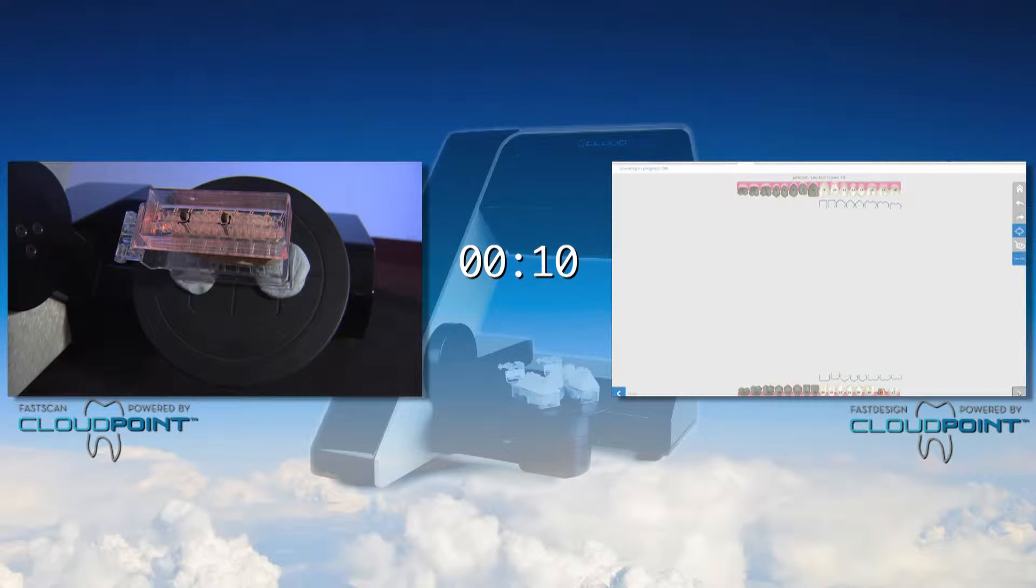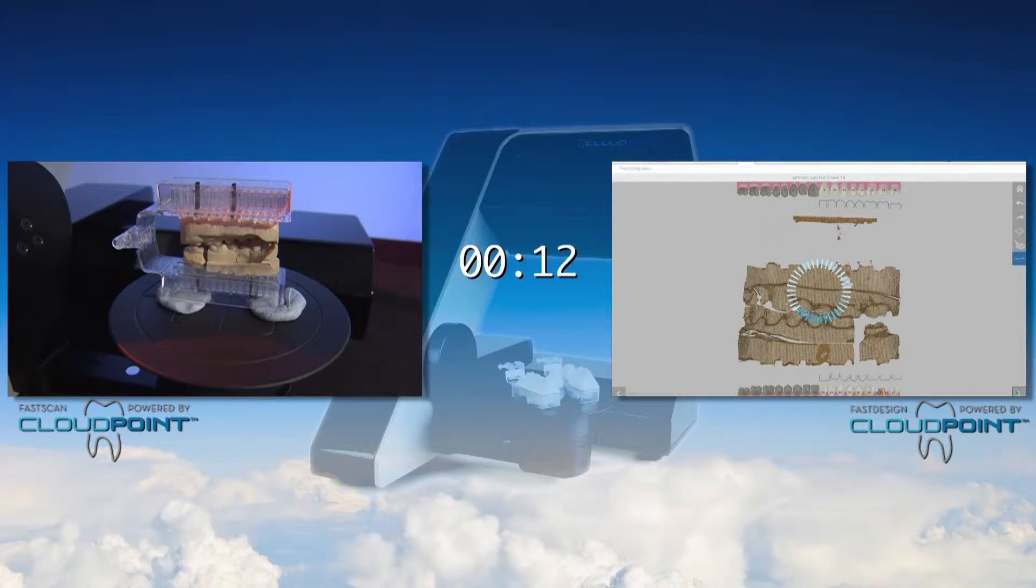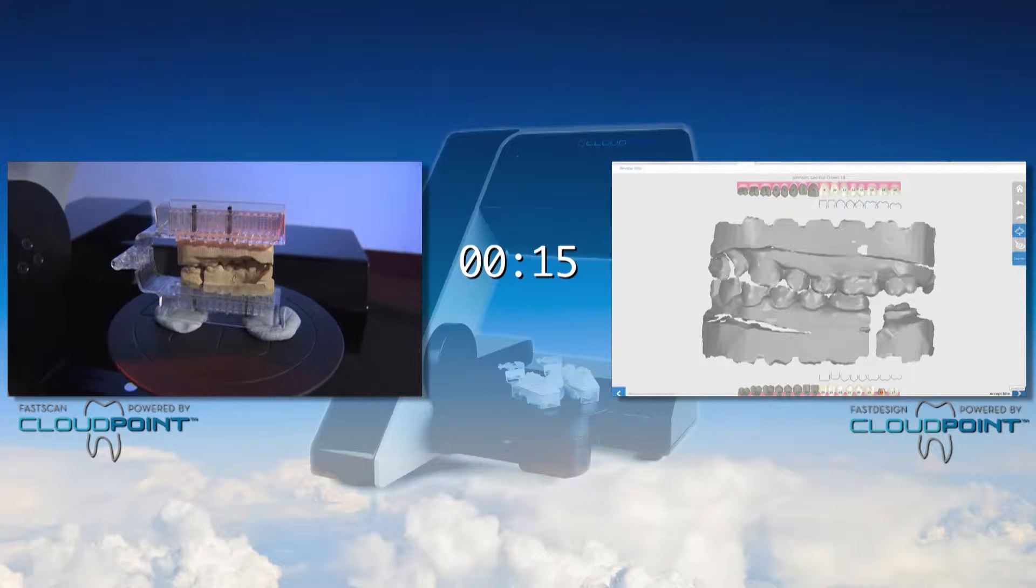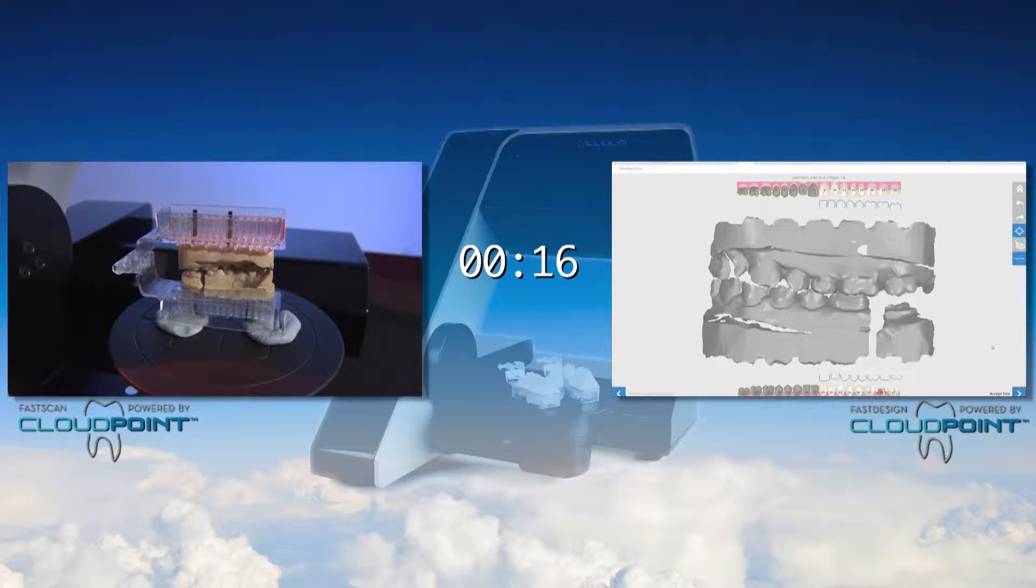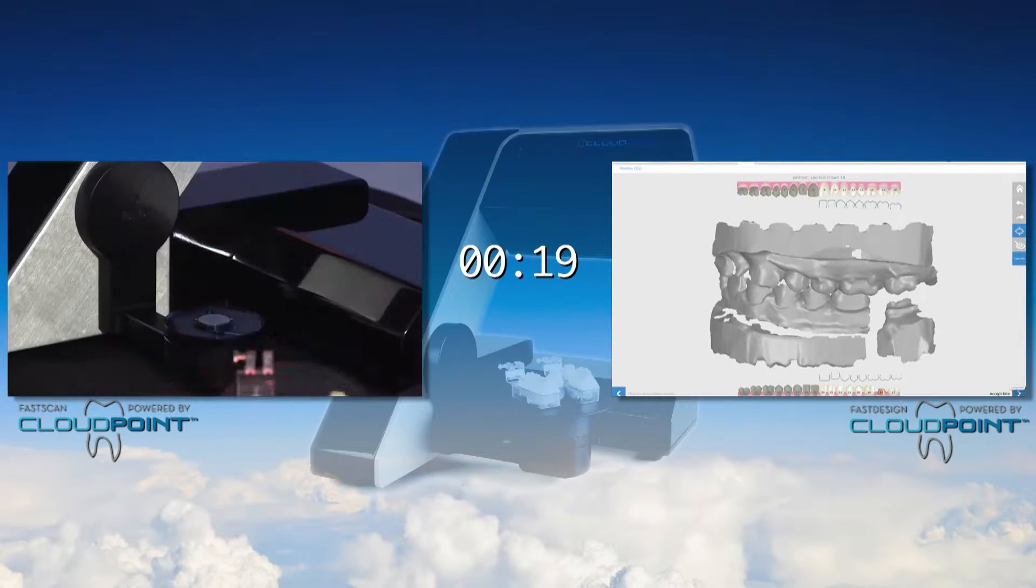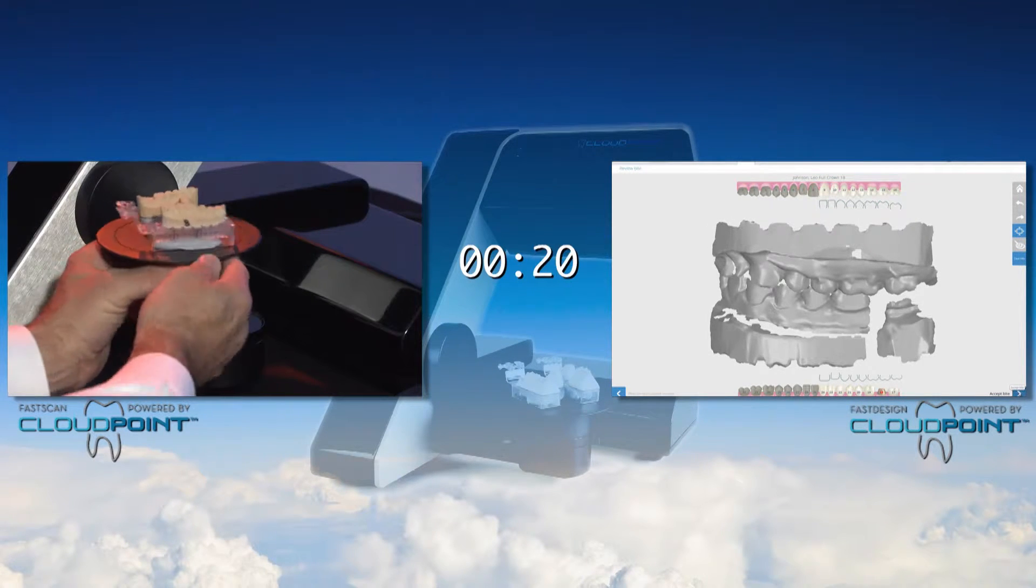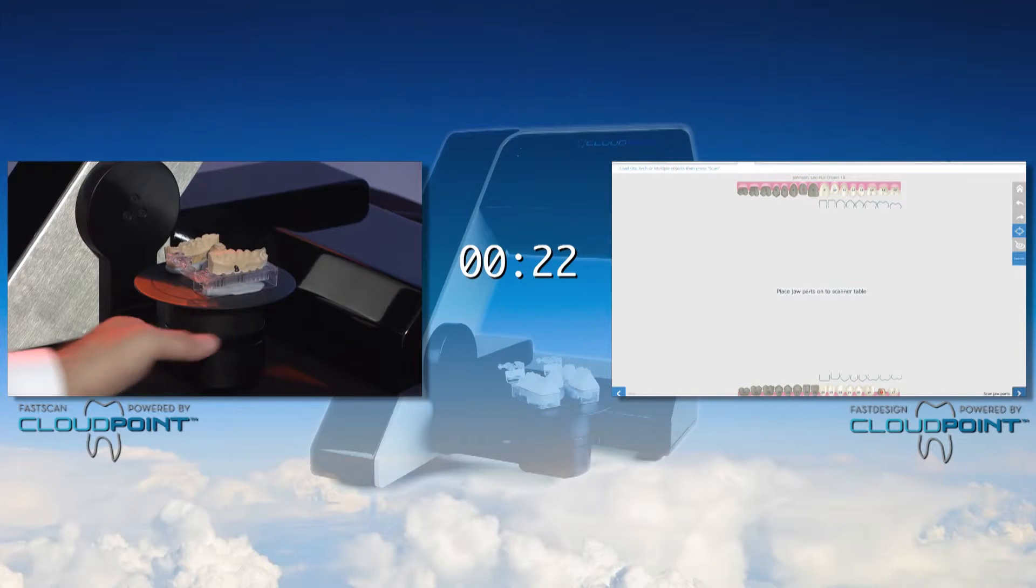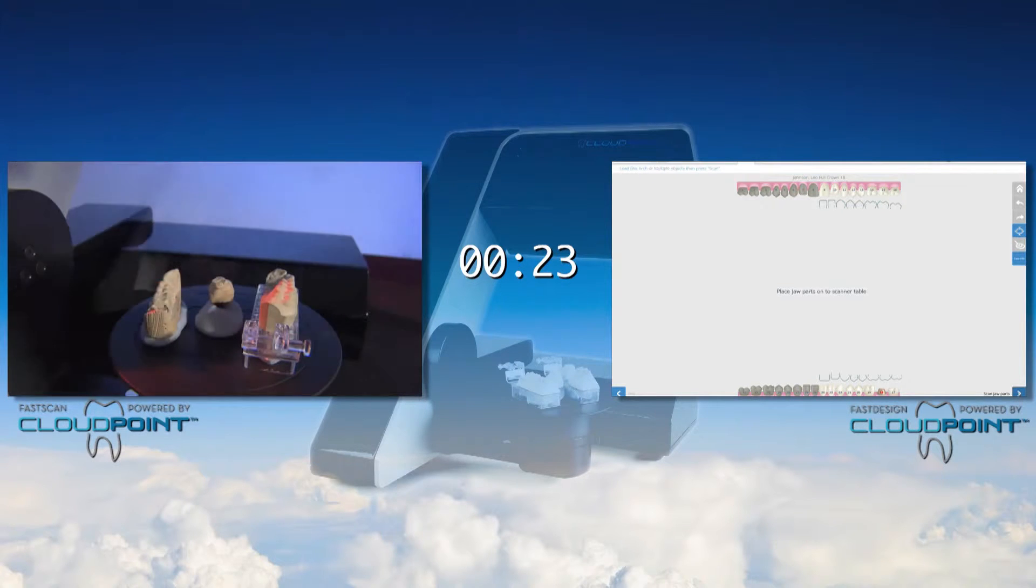It only takes a few seconds to scan the bite registration. As this is accomplished the bite scan will appear on the monitor for you to evaluate. The plate is placed firmly onto the scanner which has a magnetic attachment.